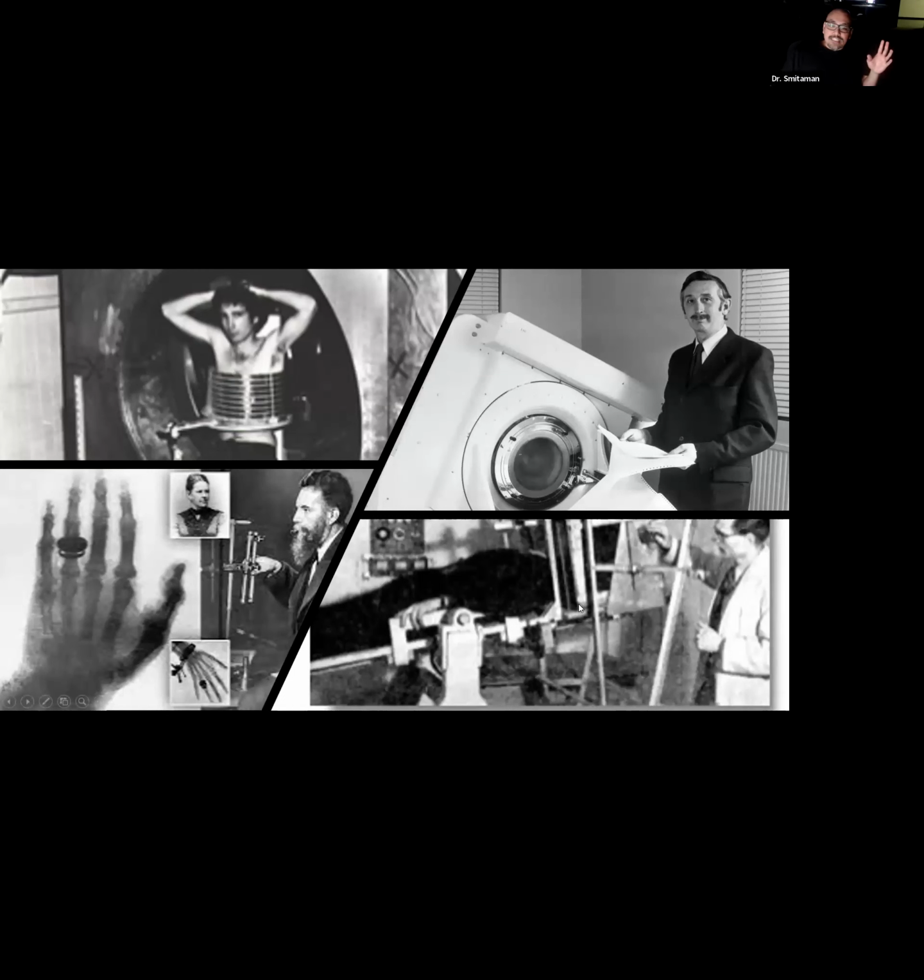In the late 1940s, bottom right corner, Karl Theo Dussik used the first ultrasound. He was, I think, a neurologist. As we know, ultrasound provides high spatial resolution of muscle, but is not as sensitive as MRI for identifying especially edema and early myopathies.